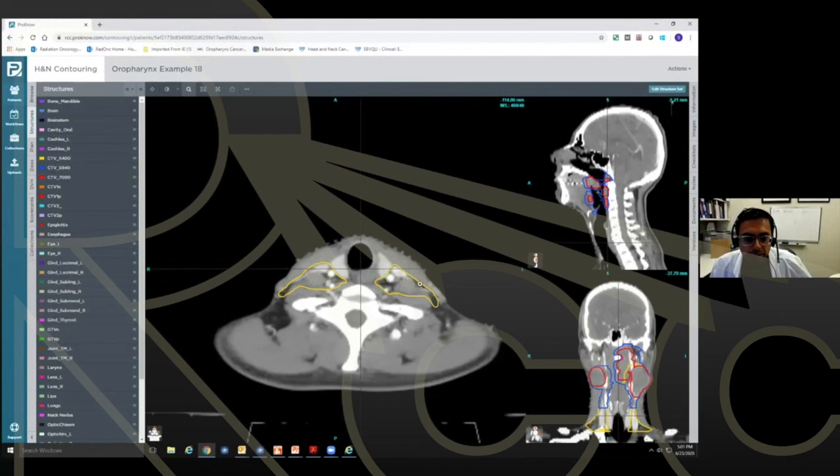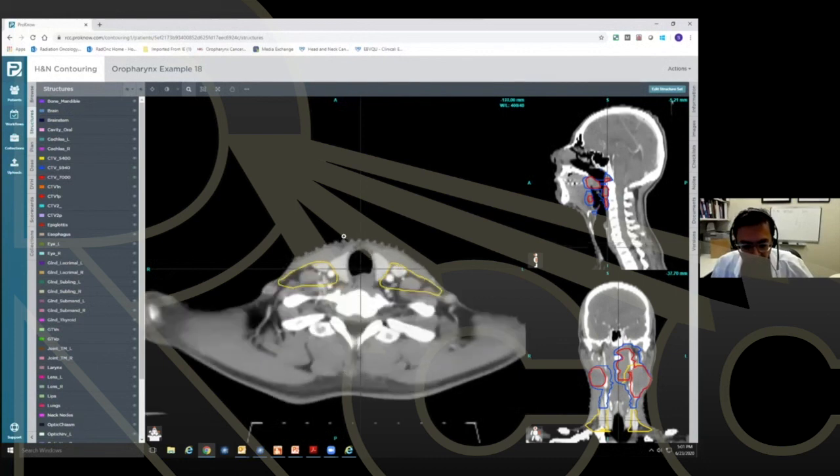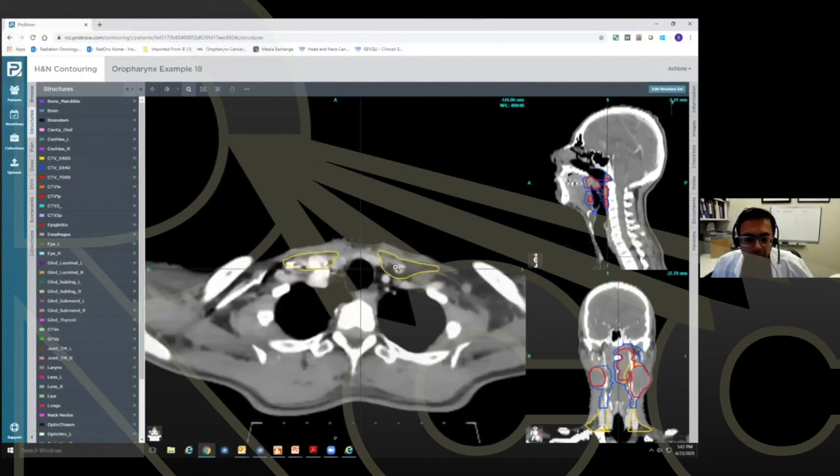Okay. And I think that covers everything. I mean, everyone asked very good questions. Again, this last slide I had was just a carotid again. Just be sure to include the carotid.